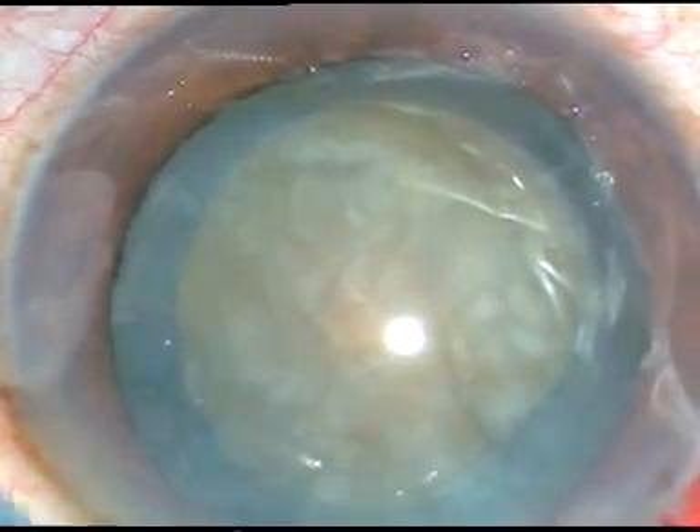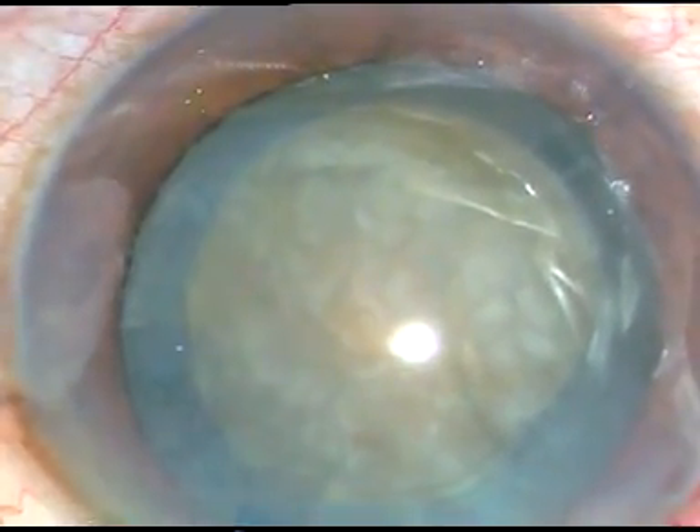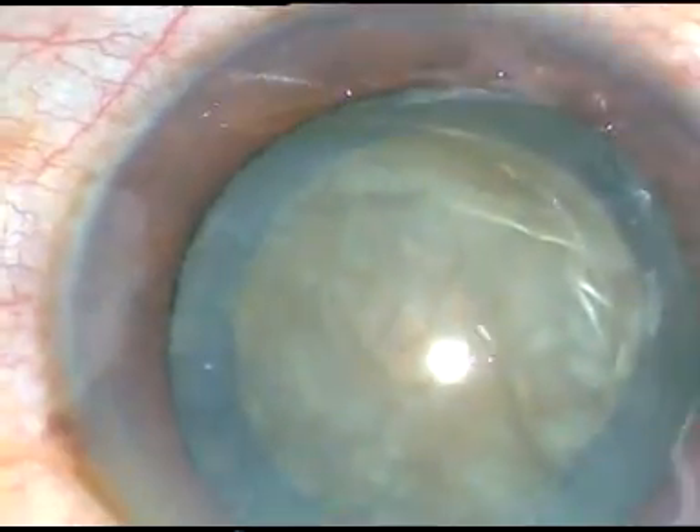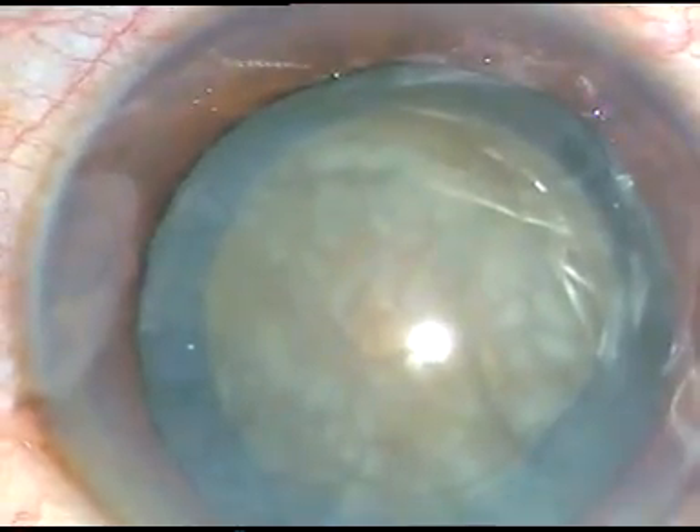Now, viscoelastic substance has been injected, and the tip of the phaco handpiece is introduced through the main incision for emulsification of the nucleus.